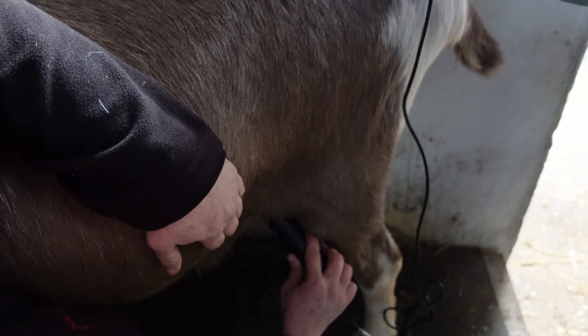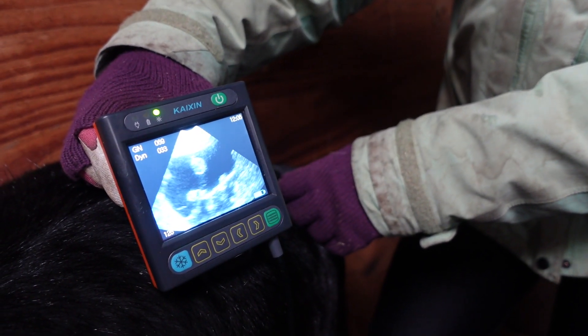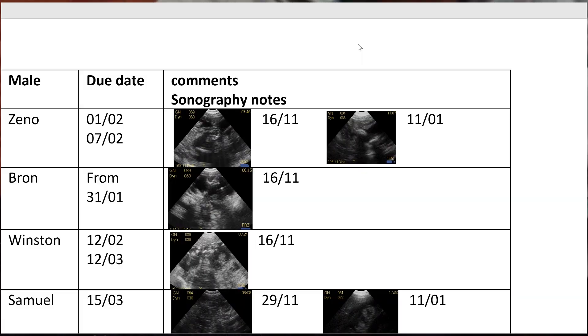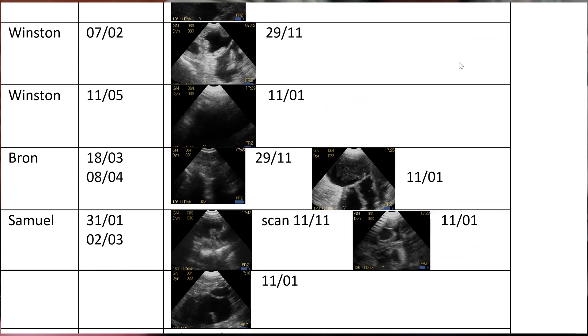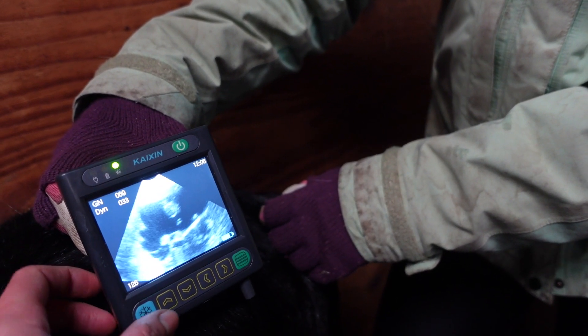I didn't realise how useful this was until I saw how Monarch Farm in Cambridgeshire were recording all of their pregnancy scans on their goats, placing a thumbnail image of each scan beside the animal's name and expected kidding date. It was a fantastic organisational tool, not to mention a great learning tool too.